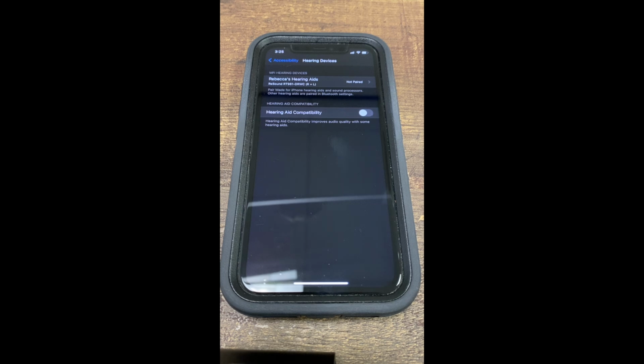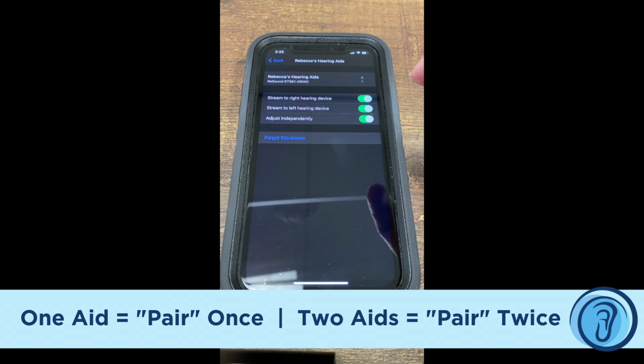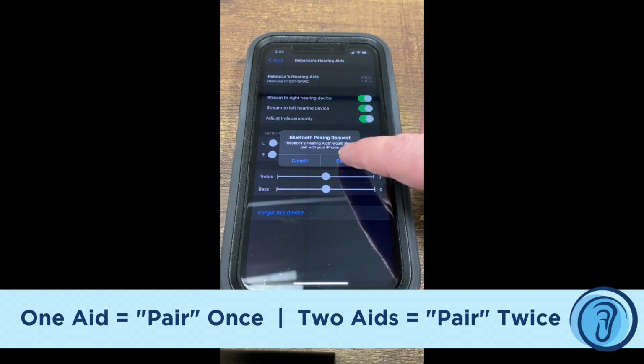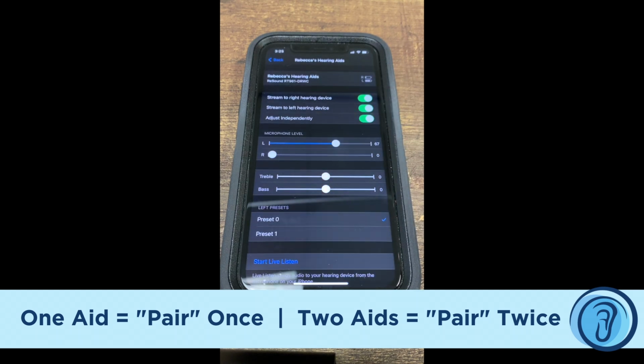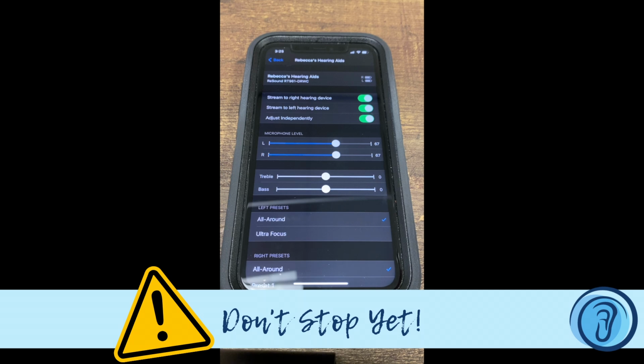Now it has found the hearing aids. Now you want to go ahead and click on your name. It'll ask you to pair, and pair one more time. And now the hearing aids are paired to your phone again.